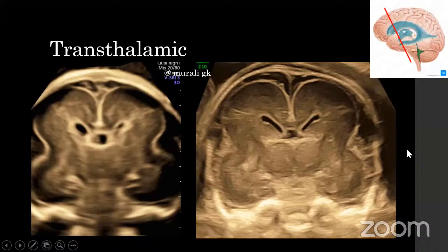So at this stage, I am looking not only at the structures of the anterior complex, I'm also looking at the thalami and the lateral fissure. I'm also appreciating a part of the subarachnoid space, and the surface of the cortex, which helps us a lot in cases of cerebral cortical malformations, maybe in late second and third trimester.